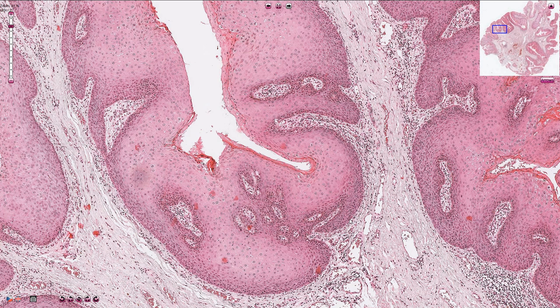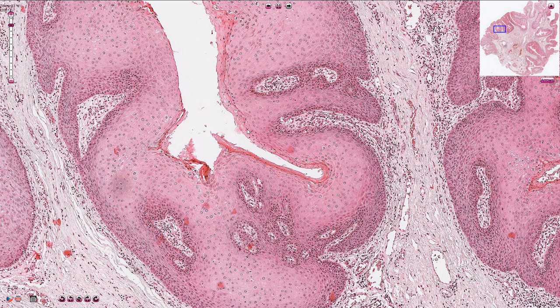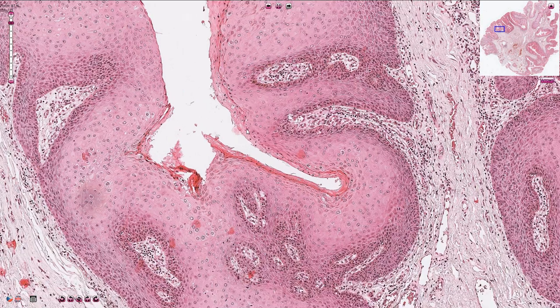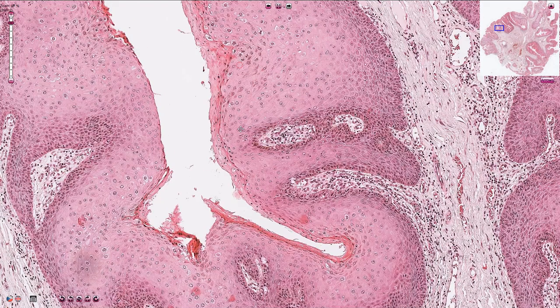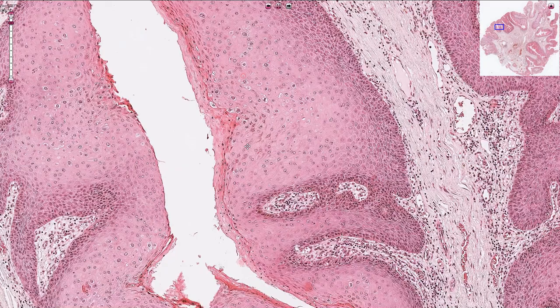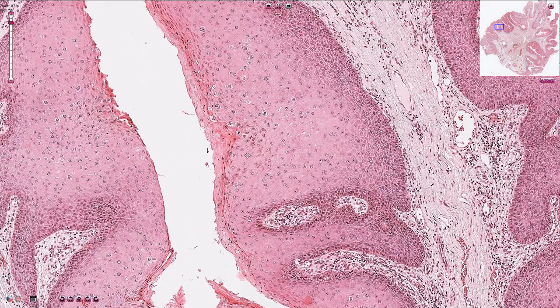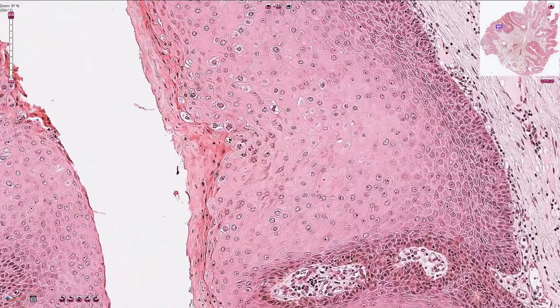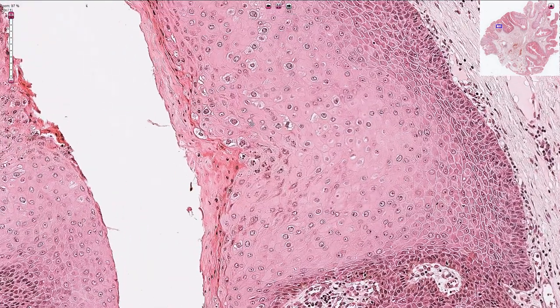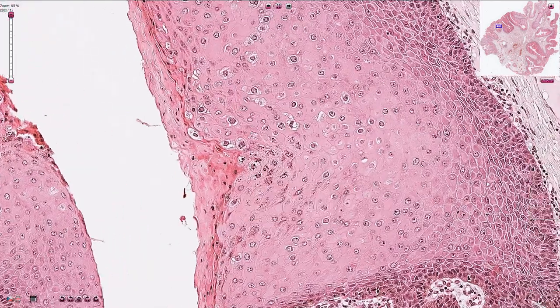On the surface we see parakeratosis, which means that the nuclei are retained in the superficial layer. A quite typical morphological feature of condyloma is koilocytic transformation of the epithelial cells, which is what we see here.